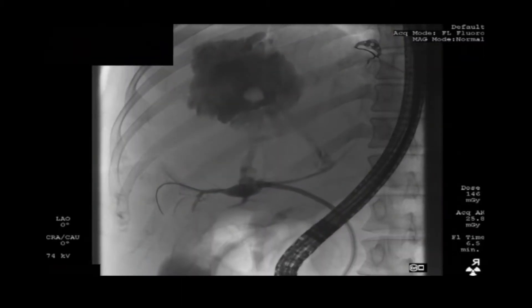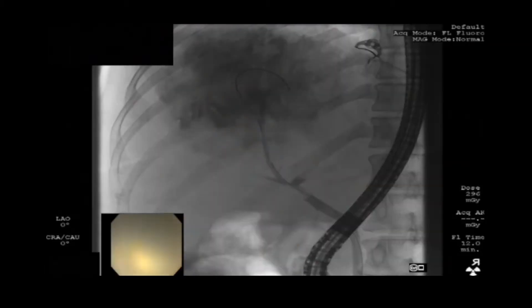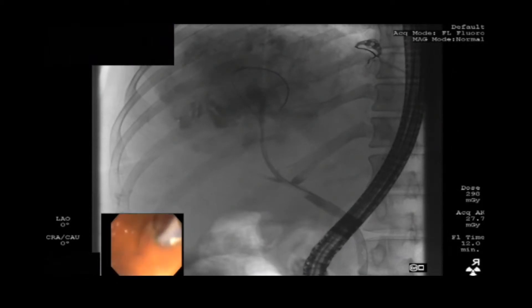The cholangioscope was passed into the common bile duct for direct visualization. Another cholangiogram redemonstrates two cystobiliary fistulas. The guide wire was passed through the right hepatic duct cystobiliary fistula and into the echinococcal cyst. The cholangioscope was advanced along the guide wire and into the right hepatic duct, stopping immediately distal to the cystobiliary fistula.